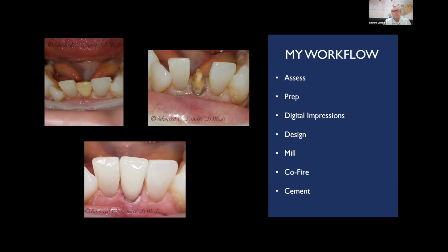And you can see again the prep. And this one's just a little bit supra in the pictures. Part of the reason that I left it like that was she had the inflammation from her existing old PFM that had been on there. And I didn't get a picture 6 months later because of all this situation that we're in. So we weren't able to see just how that gingiva looks, but I know that it has bounced right back up.